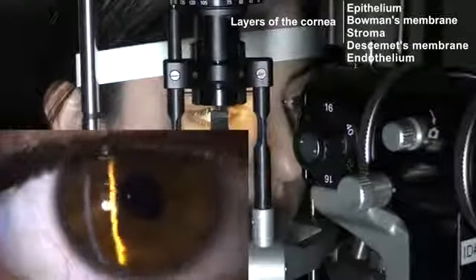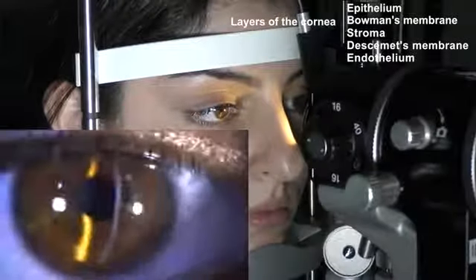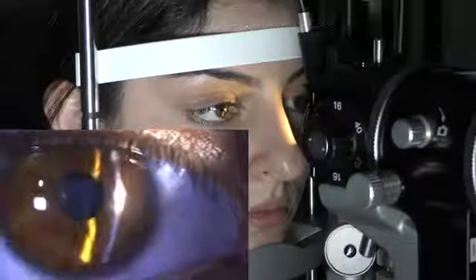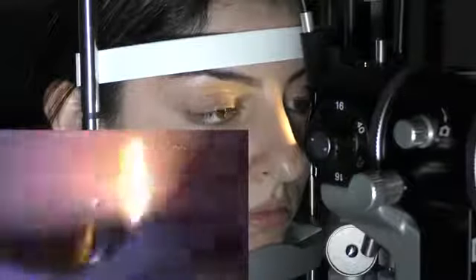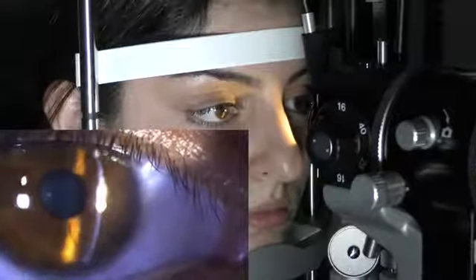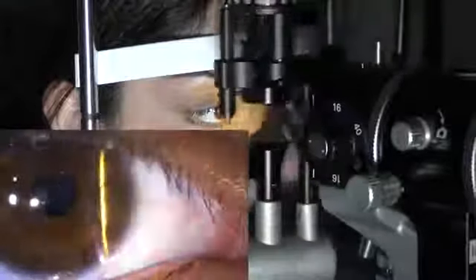Sometimes in different diseases, like for example in Fuchs dystrophy, you can see what is described as the beaten bronze appearance of the corneal endothelium. So it looks like little beads on the endothelium in the first light beam. So look for that, okay? And you can look for guttata as well, which are little beadings on the endothelium. So very important, okay, to look for all these structures. I'm also going to teach you now the van Herick method.